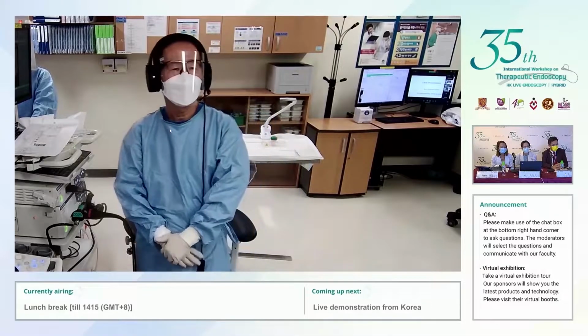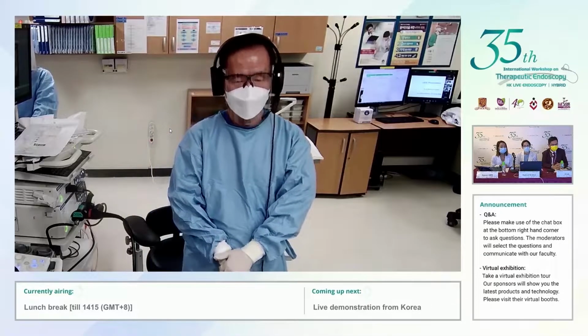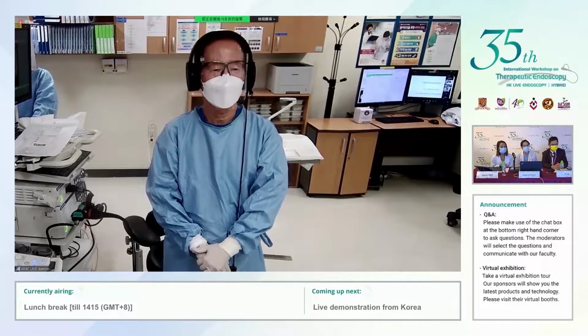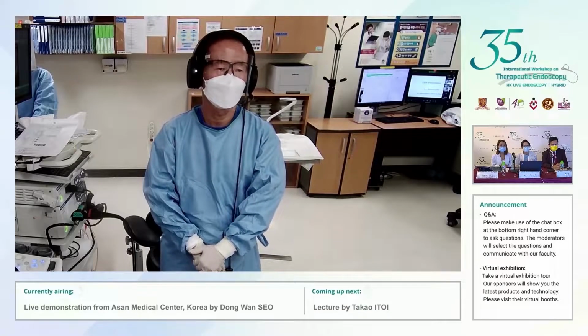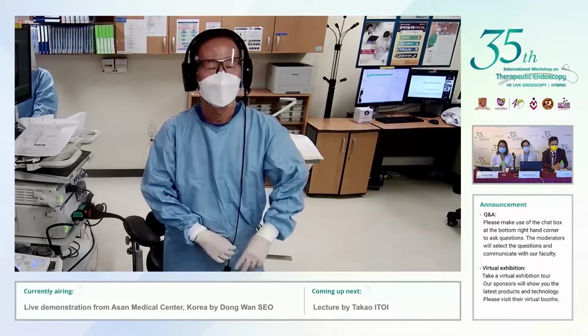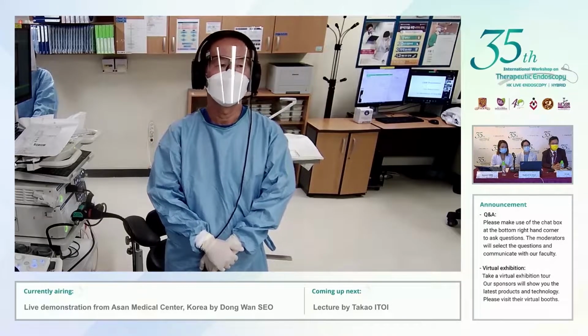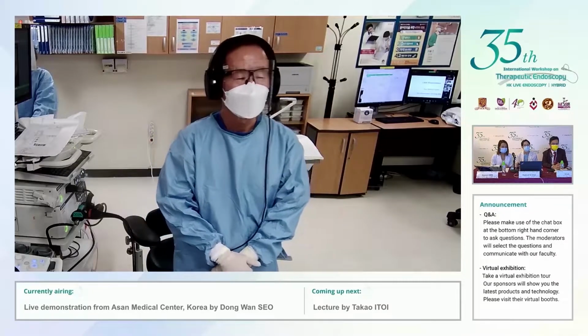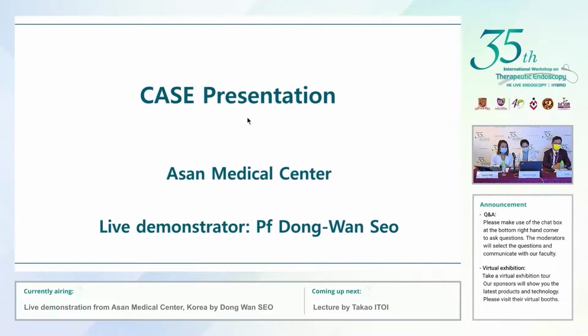We prepared one case for this Hong Kong therapeutic endoscopy live course. Although it is a Zoom meeting, I think it's our great pleasure to join this wonderful event. We prepared one case, so we will start the case presentation first.